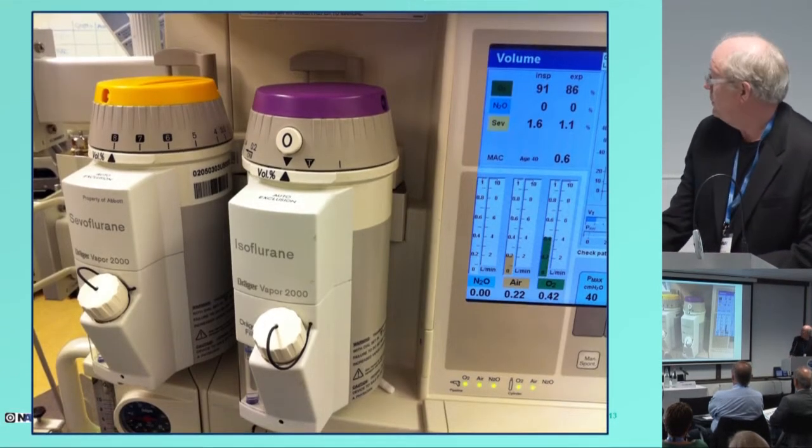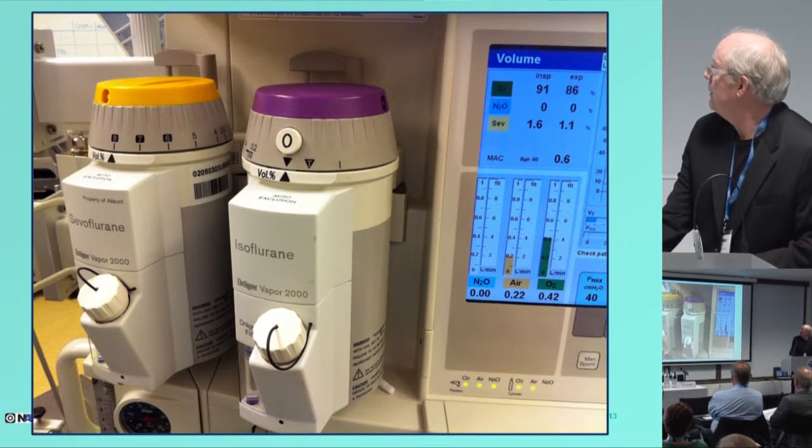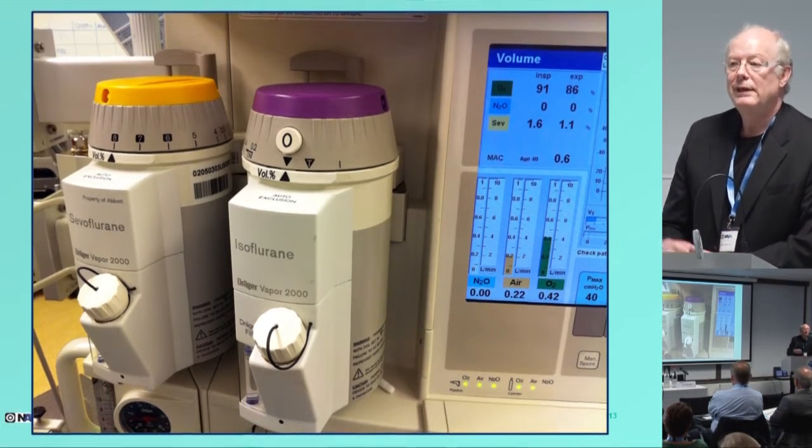So this is what I do. I start off with very low fresh gas flow, in this case slightly above half a liter per minute, 8%, and within a couple minutes I reach my desired concentration, and then I taper off my vaporizer setting to stay at my desired end-tidal concentration.